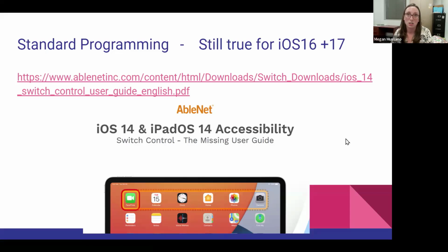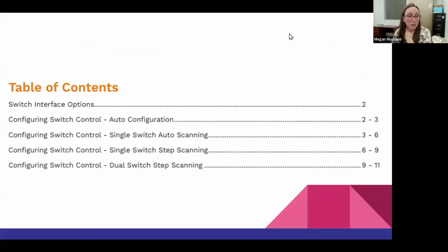If you have a student who has the cognition and the timing and the movement and the ability to understand that you click something and then it sends you to another menu to decide if you want to click or hold or swipe or pinch or scroll, like if they are able to use the built-in accessibility features, I think it's great. I don't have many students that can. So just through the nature of my caseload, I kind of had to learn something else.